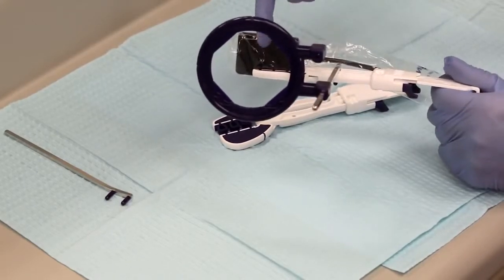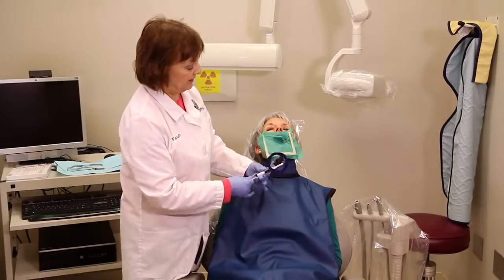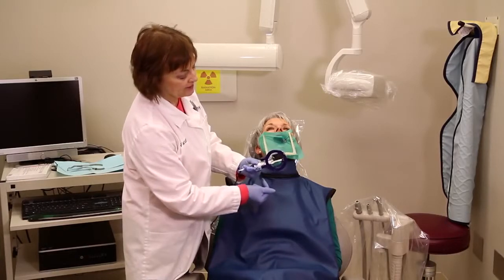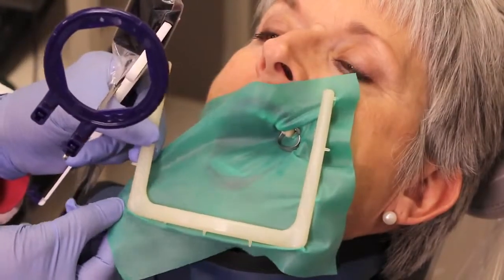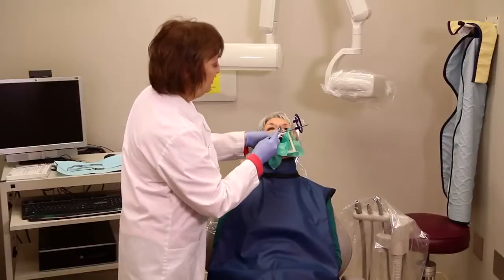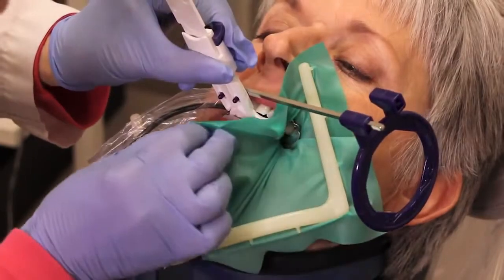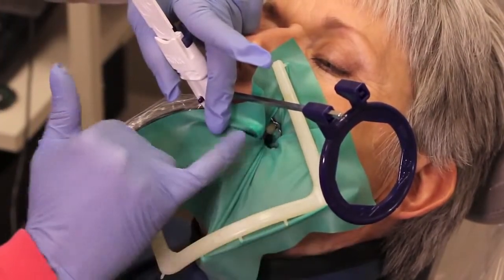Now I'm going to show you how to place this behind the rubber dam that's already placed in Sherry's mouth. The root canal we are doing is in one of the upper premolars. I've got it put together with the cutout of the Snapper on this side to allow for the tooth to come down, so the actual file will not hit anything as she is closing. What you want to do is release one side of the rubber dam, just fold it over to keep the area clean, slide it in behind the tooth through the rubber dam. Once you get that in, you can pull it back to make sure you have it in far enough to accommodate the tooth. You can see there's plenty of room for the file so it won't be hitting anything.